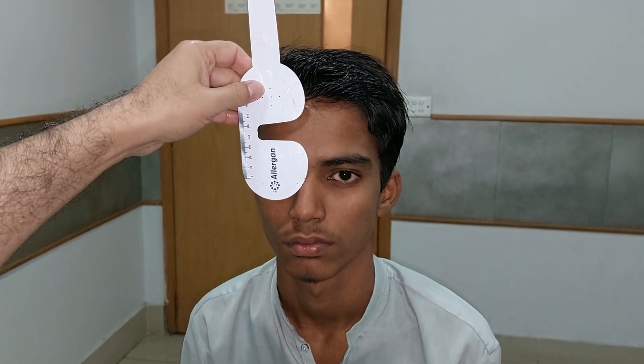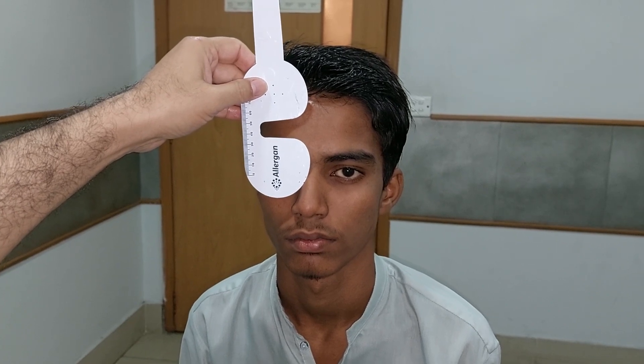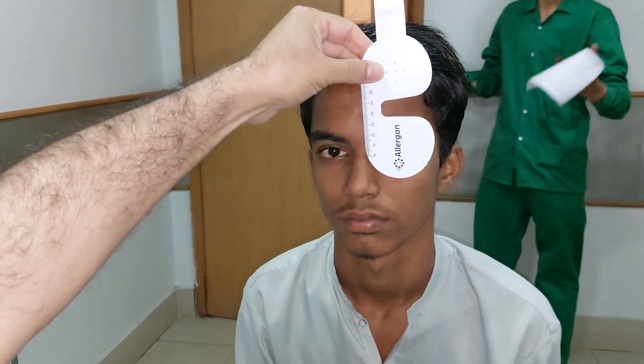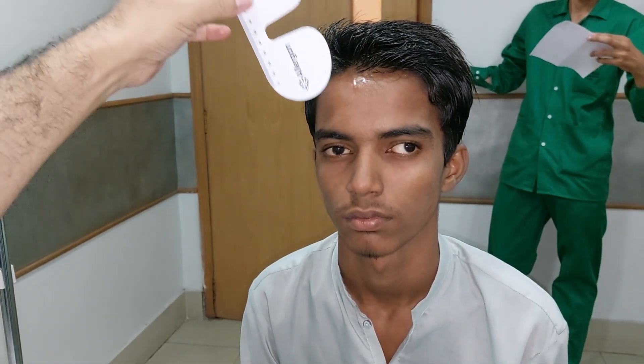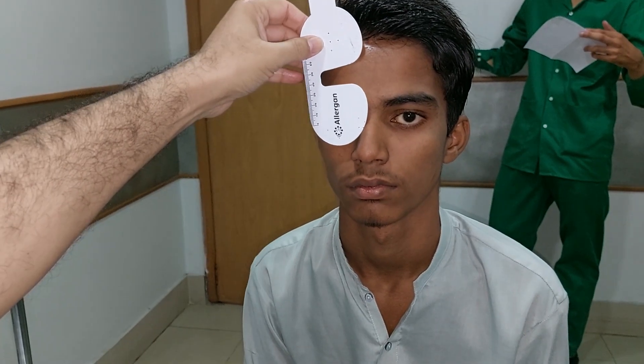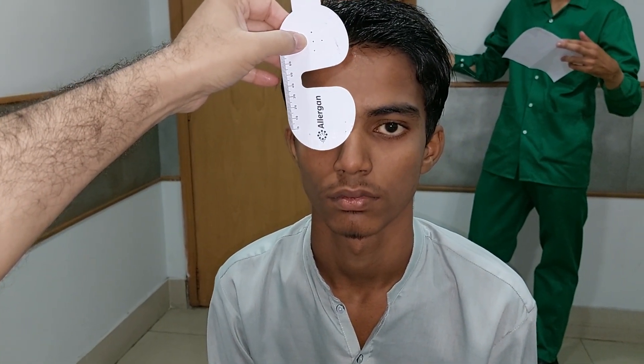The eye is divergent. Keep looking at Elias. We cover the right eye to see if the left eye takes up fixation. Upon uncovering, the right eye again takes up fixation, so the left eye is divergent. I cover and uncover — keep looking at the light — and upon uncovering, the right eye takes up fixation. So this is left divergent squint.